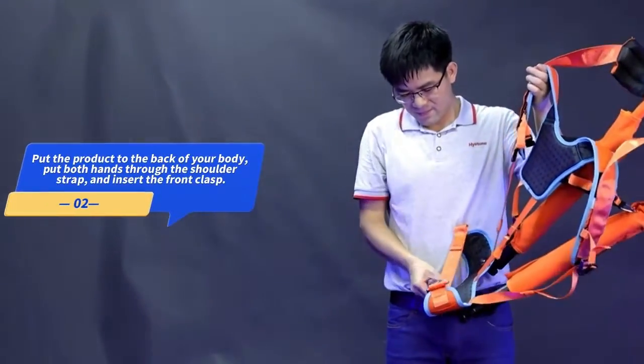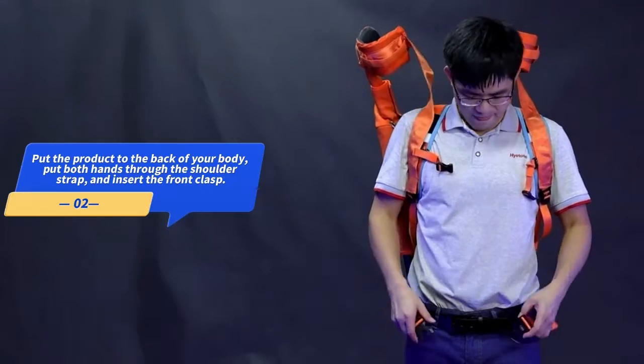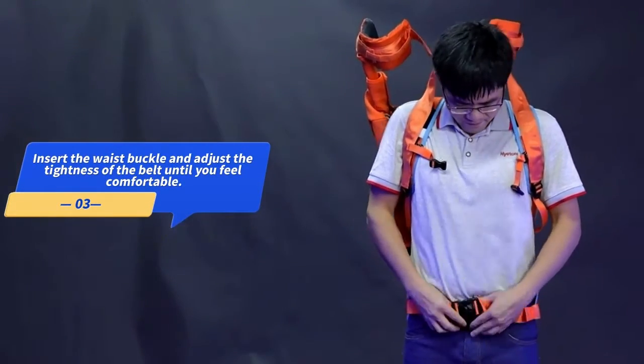Put the product to the back of your body. Put both hands through the shoulder strap and insert the front clasp. Insert the waist buckle and adjust the tightness of the belt until you feel comfortable.